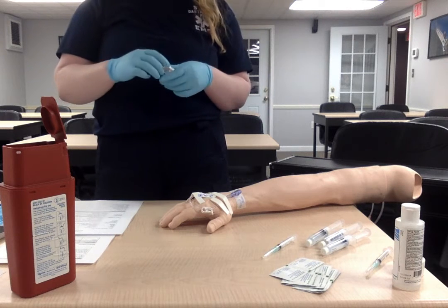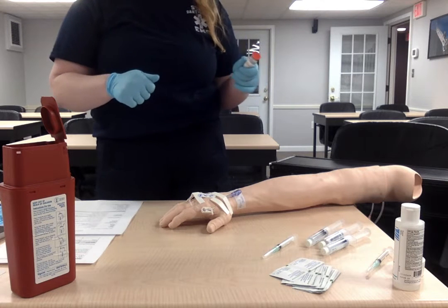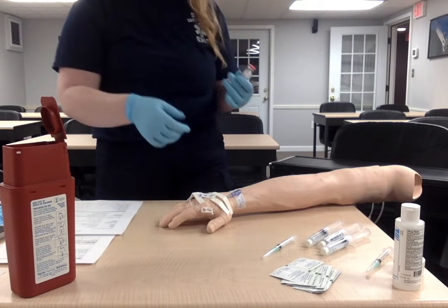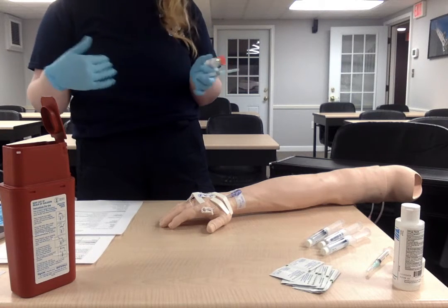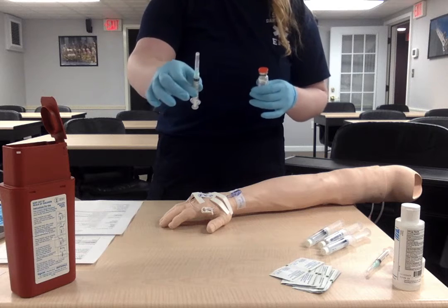So we have the bumetanide. It does have a safety cap, so we know that this is sterile and sealed. We just want to make sure nothing touches that, so it stays sterile. We also have a 3 mL syringe, because obviously we have to get 2 mL, so we need to make sure that we have enough. We have the tip on here that is covered, so again, this is all sterile.